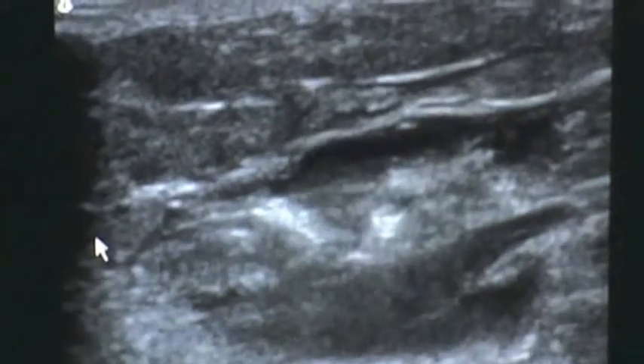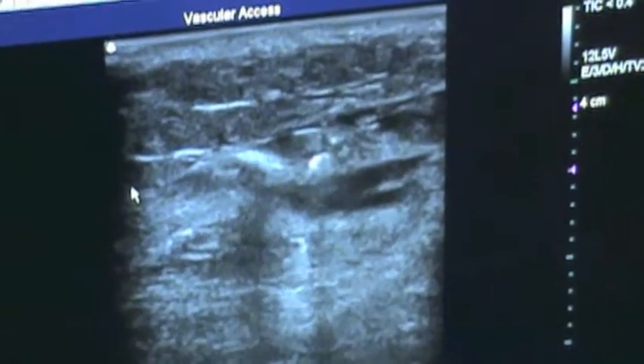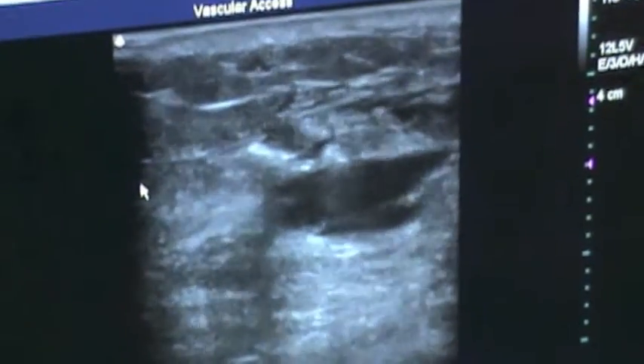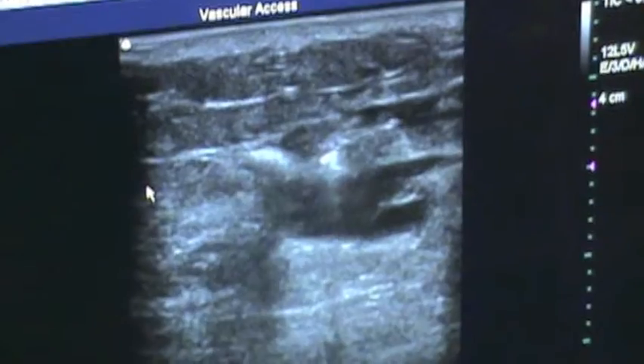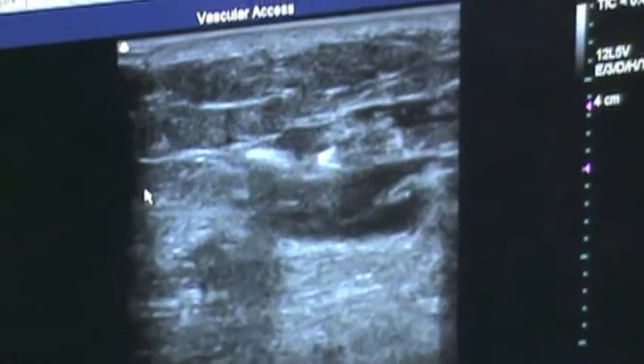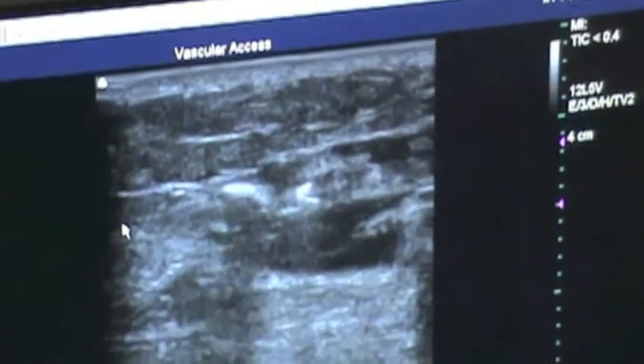This is tumescent going around the perforator. The laser tip is right in the middle, right above this little needle — right there. Now we're injecting tumescent right around the laser tip. You can see the foam on the lateral aspect there. We'll fire the laser here in just a second — there's good penetration.